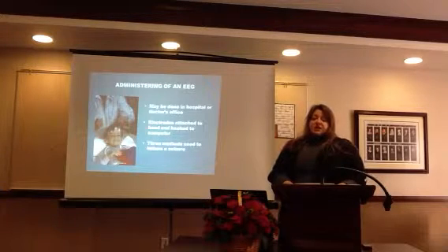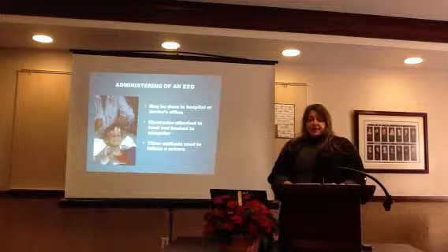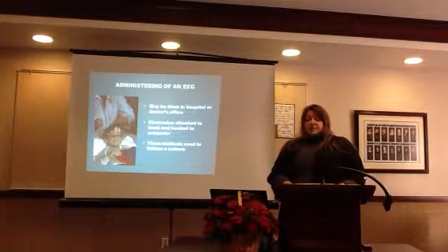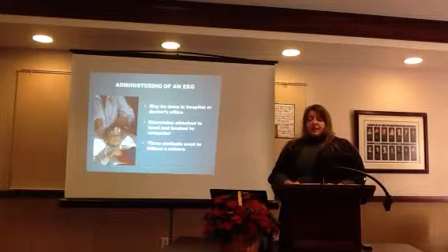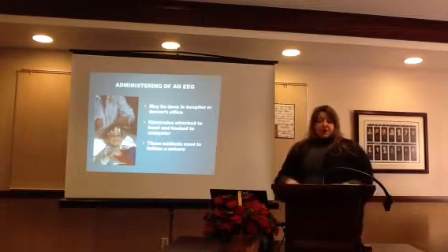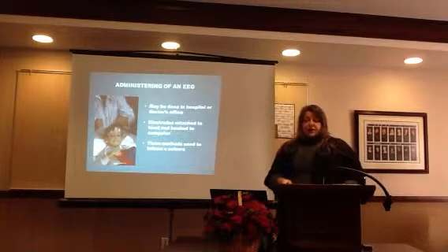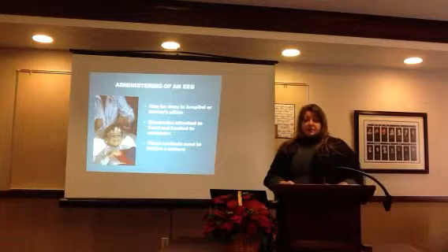The administration of an EEG can be done in a hospital or in a doctor's office by a trained technologist. There may be some instructions that are given prior to an EEG, such as no medication, no caffeine, make sure that the hair is washed thoroughly prior to arriving, but don't use conditioner, gel, or other hair care products.